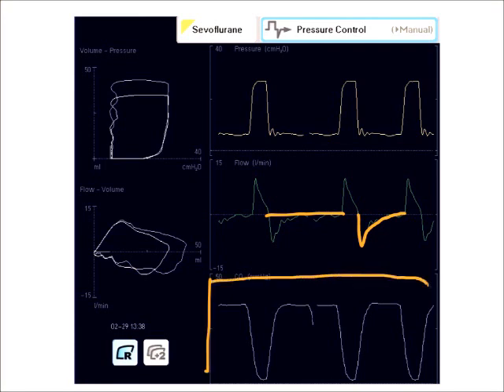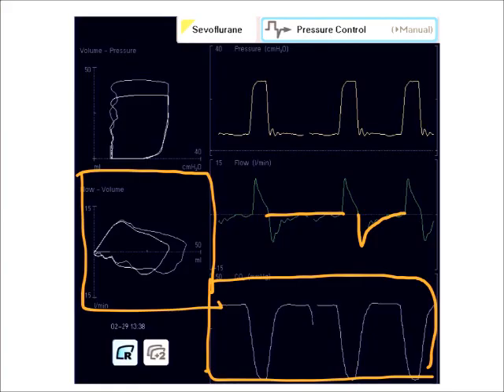I can look at also, this is a nice picture because I have my capnography, and I can see if patients have an obstructive process with capnography also. Loop. And I can assess my loops to see if there's enough time for expiration, if my flow volume loops return to my baseline too. So that's expiratory time.